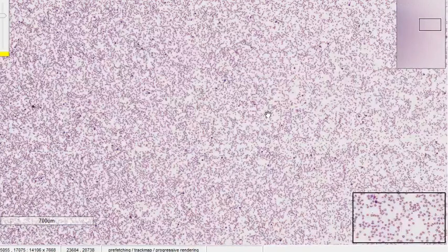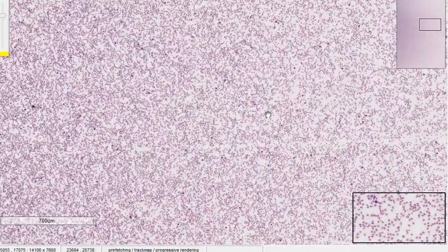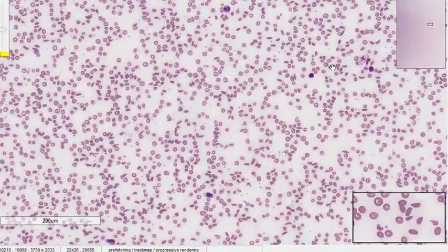We have a certain order for reporting a peripheral smear: first we look at the RBC series, then the WBC series, and lastly the platelet series. This order ensures we don't leave out any findings or miss any type of cell. We will follow that order — first RBCs, then WBCs, then platelets — and hopefully reach a diagnosis.